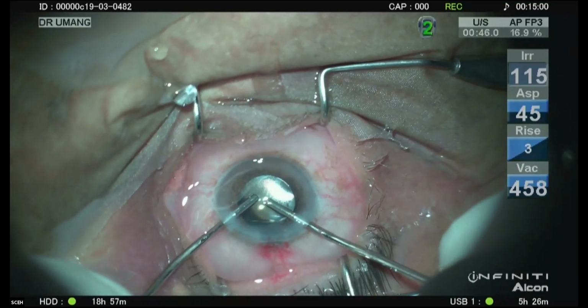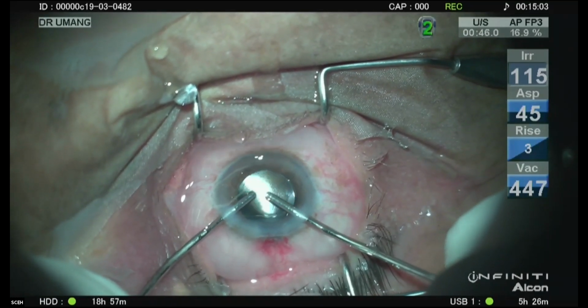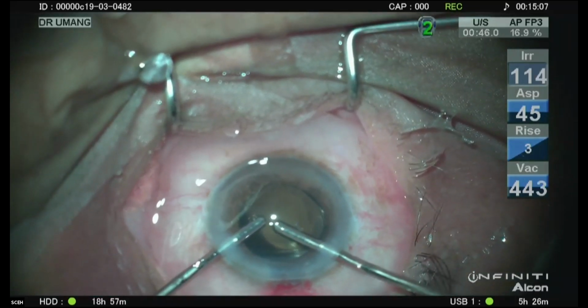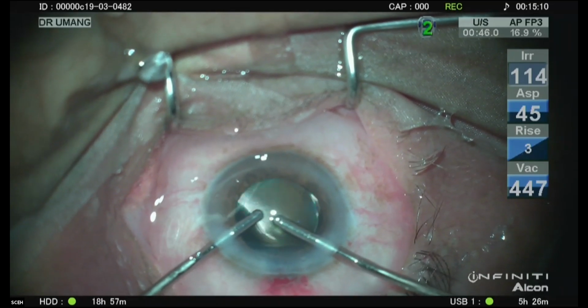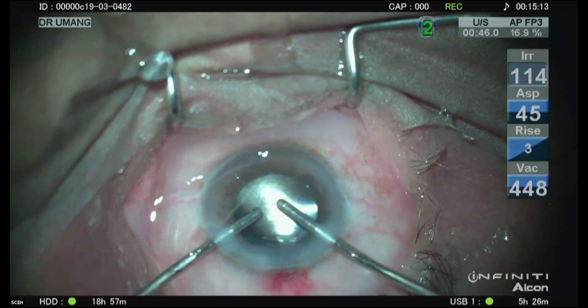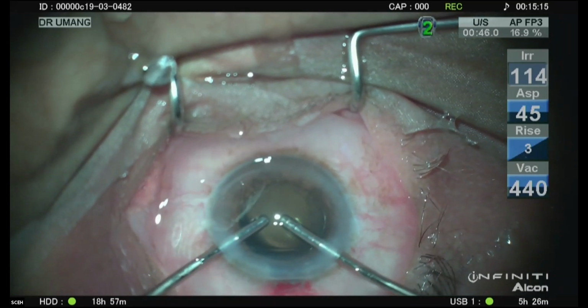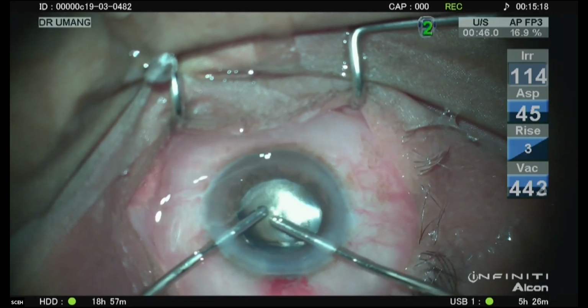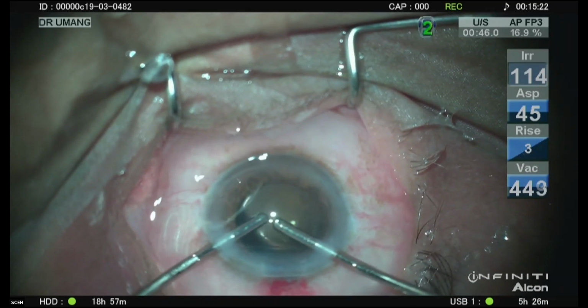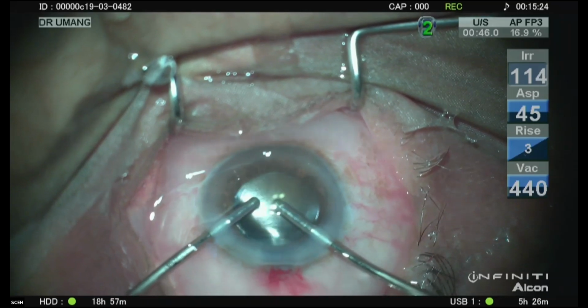It's important to remove almost all the viscoelastic, especially if you're using a dispersive viscoelastic. It can tend to stick to the lens material, so be patient to remove it. A cohesive viscoelastic, of course, comes out as a bulk. So the Duovisc helps in having both the properties.